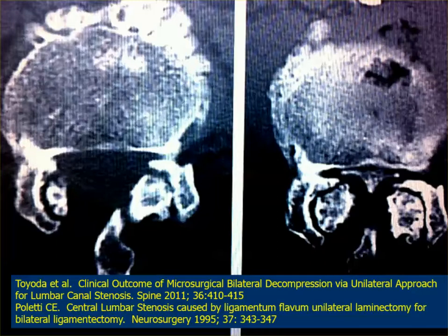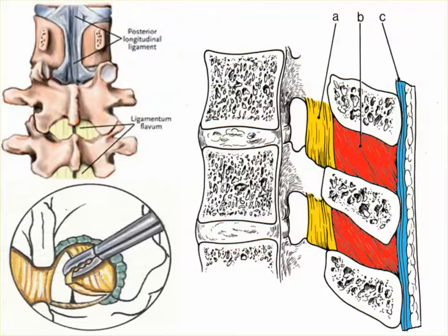Now, I started doing this on my own when the microscopes got better. It was an evolution of the porthole technique. I thought I invented this technique, and I was doing it on my own. But it turns out people were doing it in '95, and people do it all over the world, really. The reason this is getting popular is the microscopes have gotten better, so it's easy to do this. It used to be hard to do.